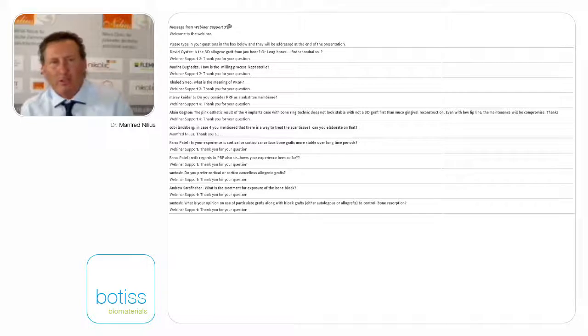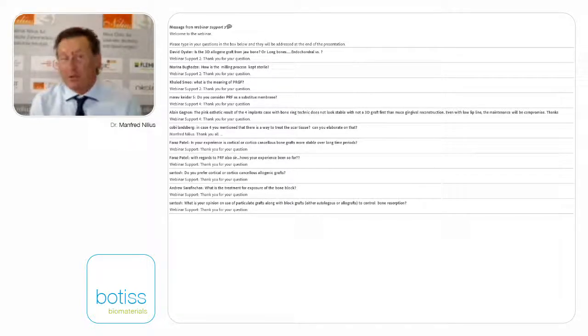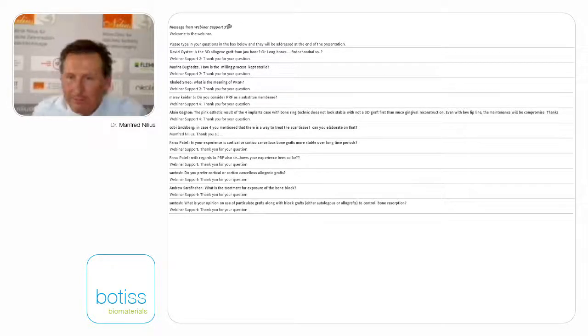So the growing of the soft tissue is going and going. Then you have mucosa, but when you have implantation, you normally use gingiva. So later on, you have to make a gingivoplasty to fit very good to the implant region. Oh, thank you very much. Yes, okay.